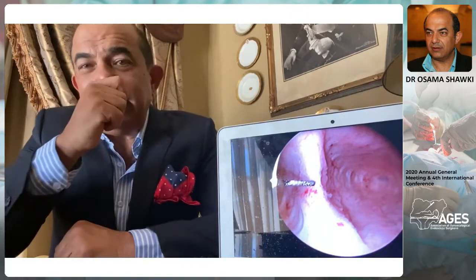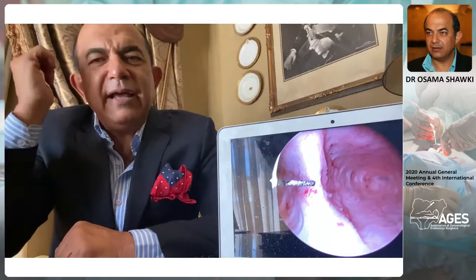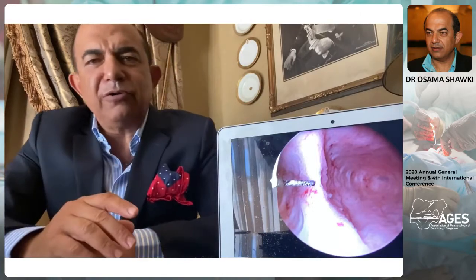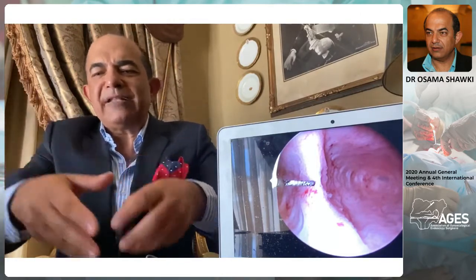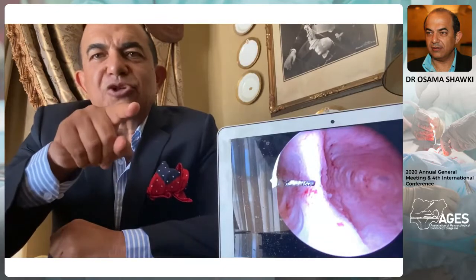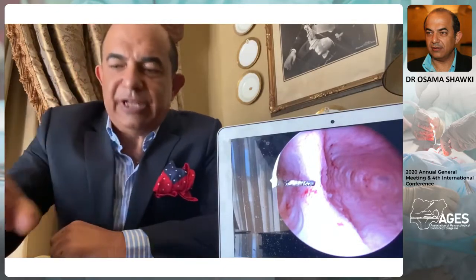And remember that in laparoscopic surgery, it is not your job to do this. Somebody else from the nursing staff will adjust the pneumoperitoneum machine to pressure 15, and then you work all the time. Rarely you open to decompress smoke during work, but you don't need to play much with the inflow and outflow. But in hysteroscopic surgery, it is your job. And this is the secret of the good hysteroscopist.